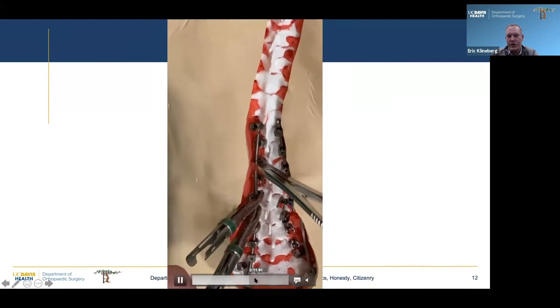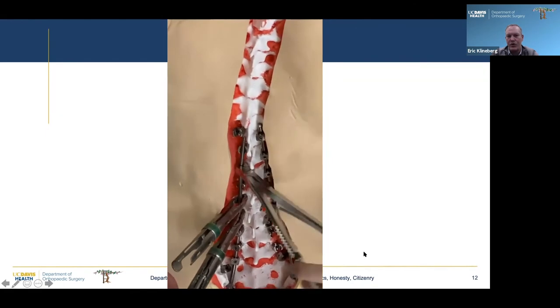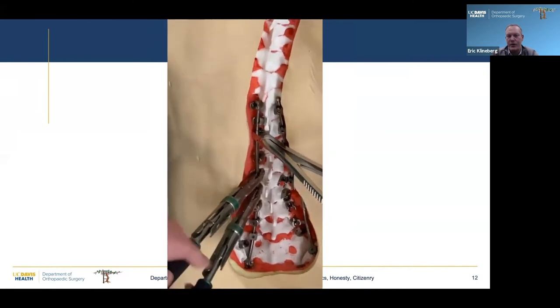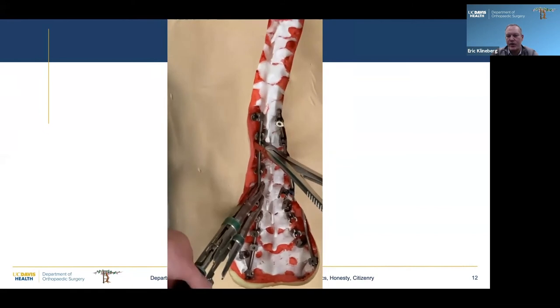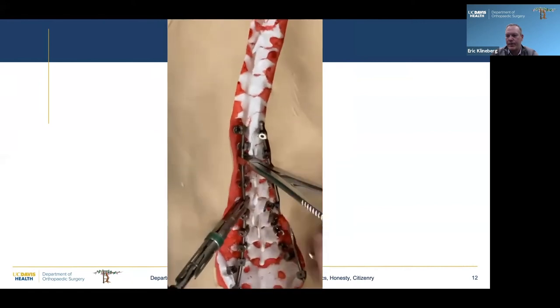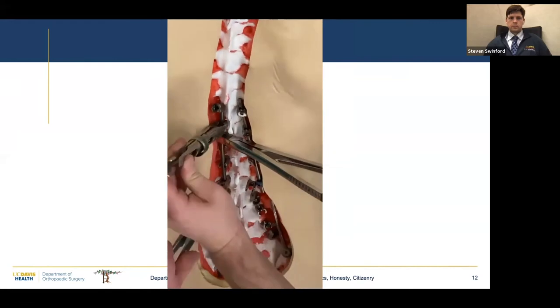And then the key thing you'll notice is I don't put a set screw in the top screw because I really want that to be no stress. And it's bent down into that tulip, so it's really pushing down on the spine to make sure we decrease our rate of PJK. I think that's also critical. That's where you corrected me from putting a reduction tower on there.